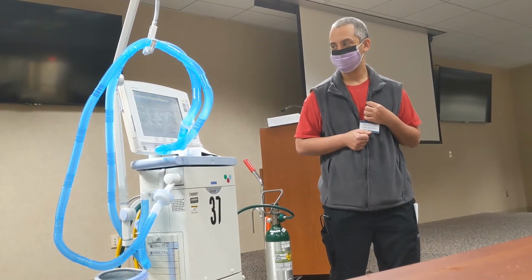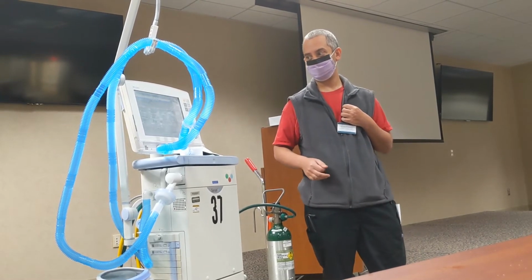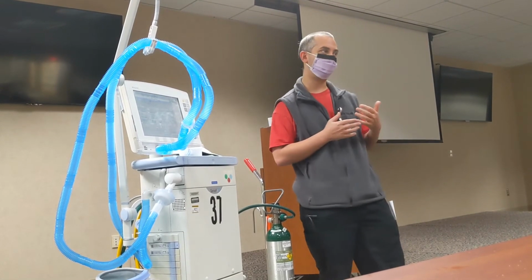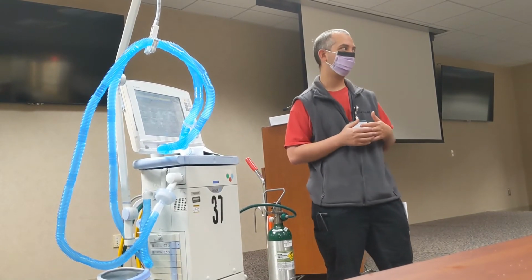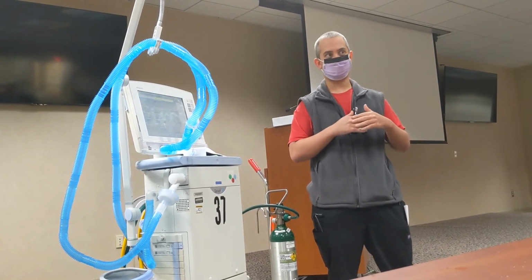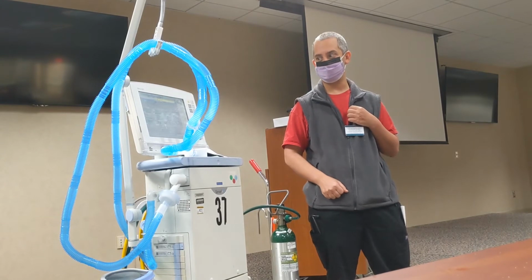So let's see. And then the last couple that we don't use very much, but you may in the near future, is your pressure support above P high. And that's more for when you're starting to wean someone a little bit, they're starting to take some more breaths on their own, and you're looking to decrease the P high some, but allow them to still ventilate by taking the breaths above and beyond on their own.